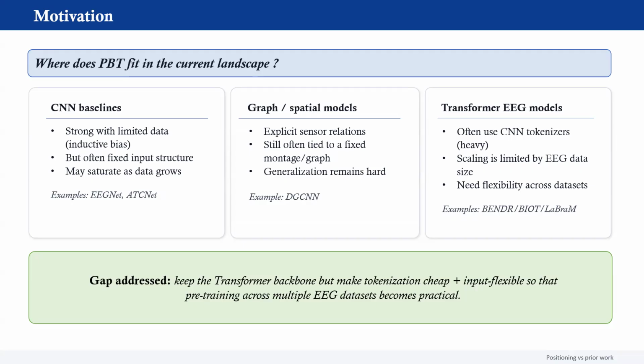So basically, there are certain models in which we treat the EEG input as an image. Either you can treat the signal itself as an image, or you can do certain frequency transforms to generate spectrograms, which basically represent the frequency content of the signal. And these are then given as input to the model.